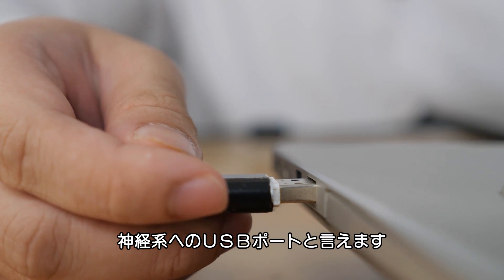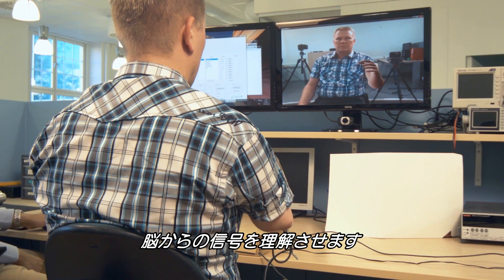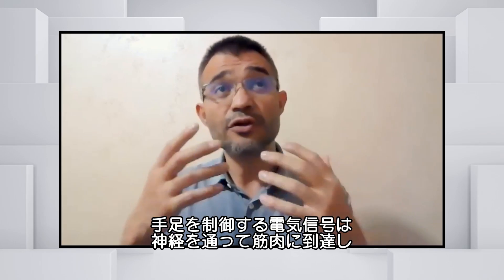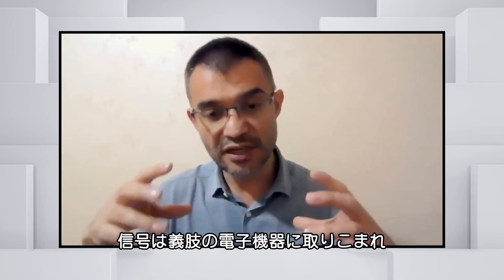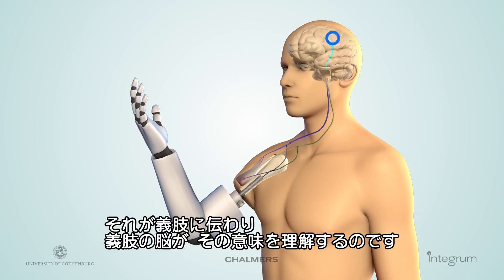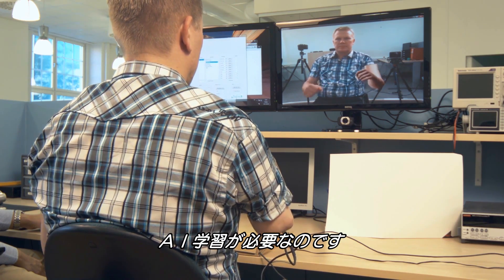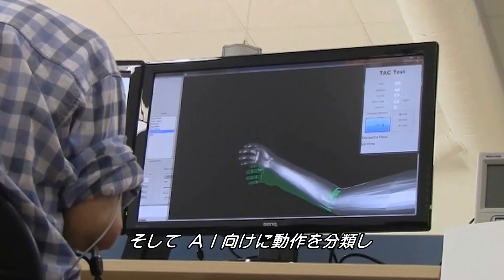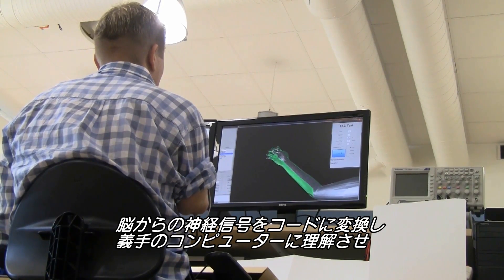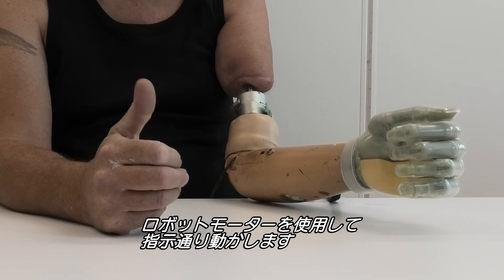You can think of it as a USB port into the nervous system. The next step involves training the AI in the bionic hand's CPU to understand what signals from the brain mean. Limb control comes via electric impulses traveling down through nerves to muscles. Those signals are captured by the prosthesis's electronics and interpreted by its brain. The CPU doesn't automatically know what those activation patterns mean, so the AI must be trained. The patient is asked to try to close or open their hand while signals are recorded and labeled, translating neural signals into code that the prosthetic computer understands, engaging its robotic motors to move in specific ways.